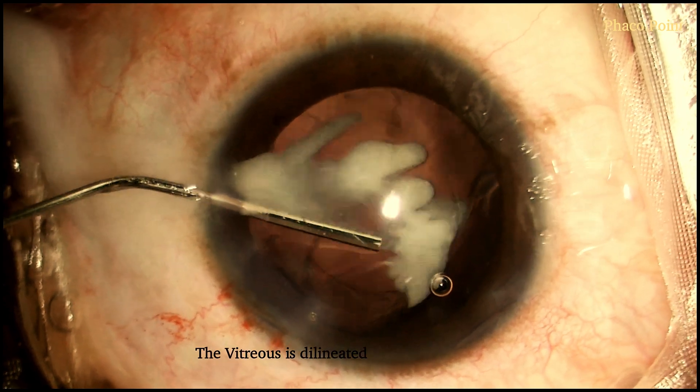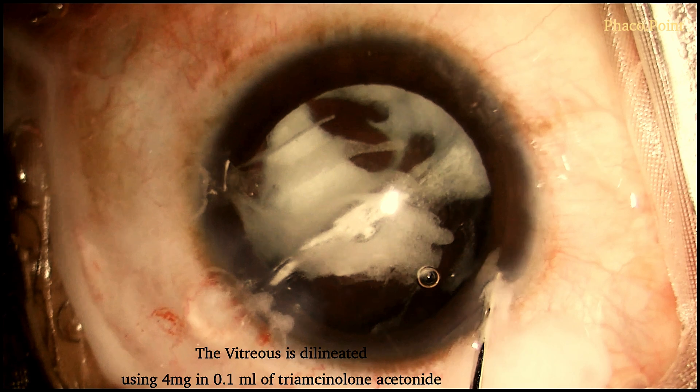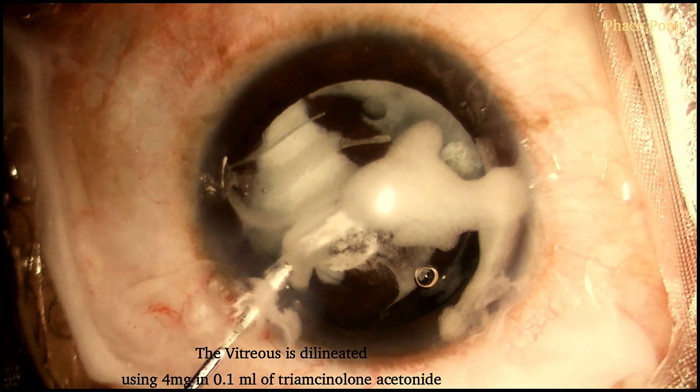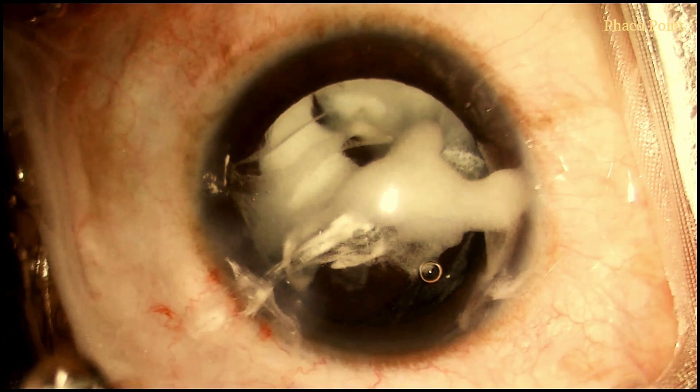In order to confirm the presence of a disturbed vitreous, 4 mg and 0.1 ml of triamcinolone acetonide is injected into the anterior chamber. The delineated vitreous appears like this. Notice the stained vitreous prolapsing out of the incisions. Almost always you'll find that when the vitreous is disturbed, it tends to move to the path of least resistance, that is the incisions. You can also notice the disturbed vitreous filling the anterior chamber.